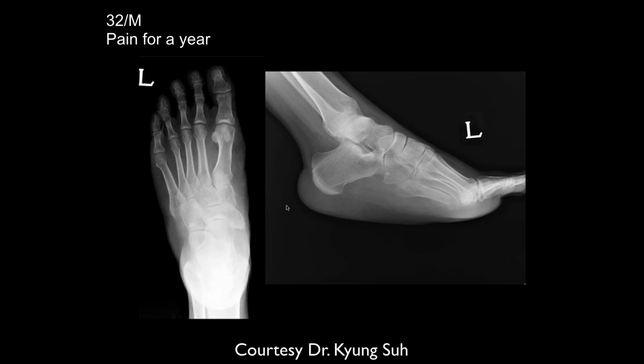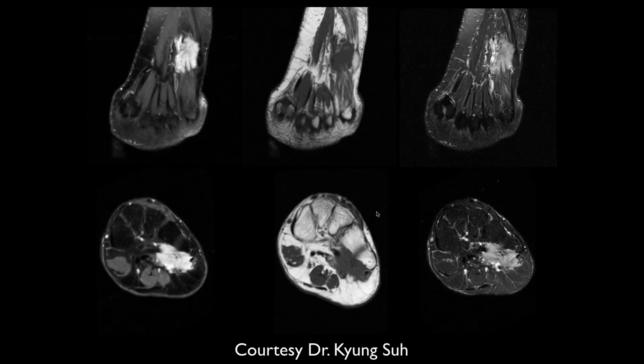Yep. We got a 32-year-old male with pain for 1 year. So we got a frontal and lateral radiograph of the foot. We see what looks like a soft tissue mass or thickening of the heel fat pad. And I don't see any obvious bone finding.